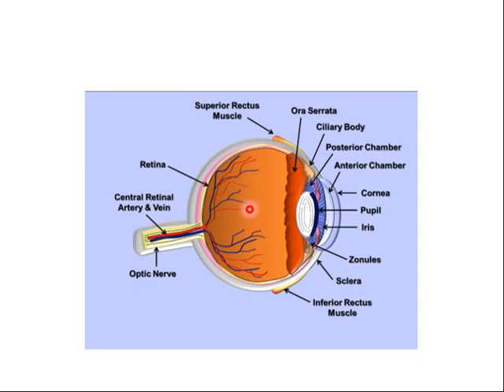So we have the anterior segment and posterior segment. The anterior segment contains the anterior chamber and posterior chamber. And the posterior segment contains the vitreous, the bulk of the eye. The vitreous, yes. And now the layers of the eye globe, three layers.